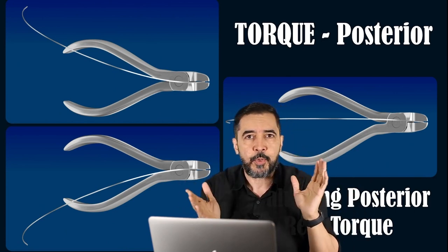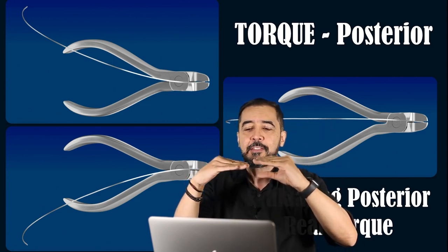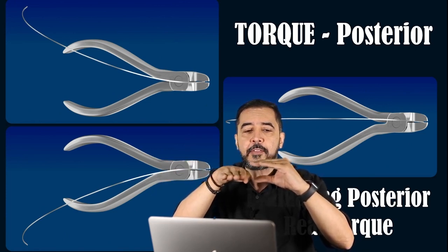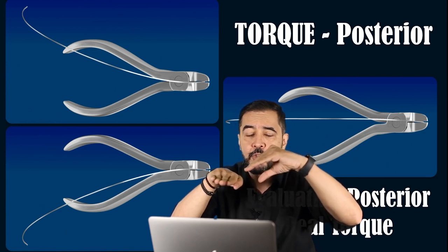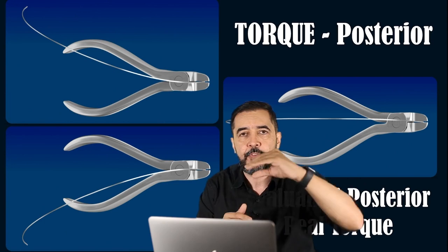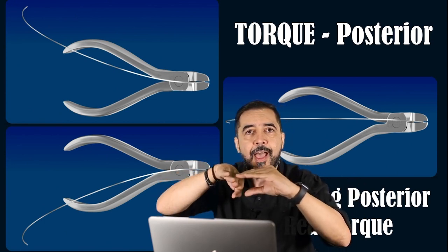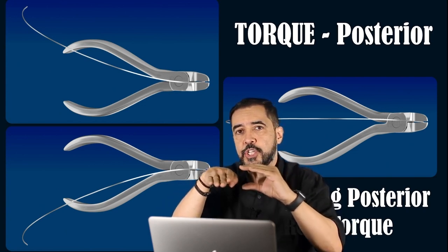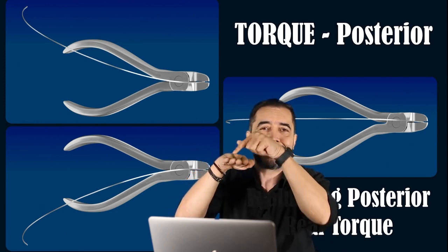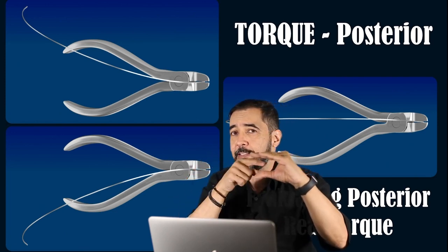So this is the most important thing. I always say the same thing to you because I consider this very important: the relationship between the torsion of the rectangular arch wire and the inclination that this rectangular arch wire will find when it goes inside the slot. So we have the slot with very varied inclinations. We can do this, do that, and we have this difference in the relationship between the inclination of the torsion of the arch wire, meaning this is my arch wire, this is my hand representing the rectangular arch wire, and this is the slot, okay?